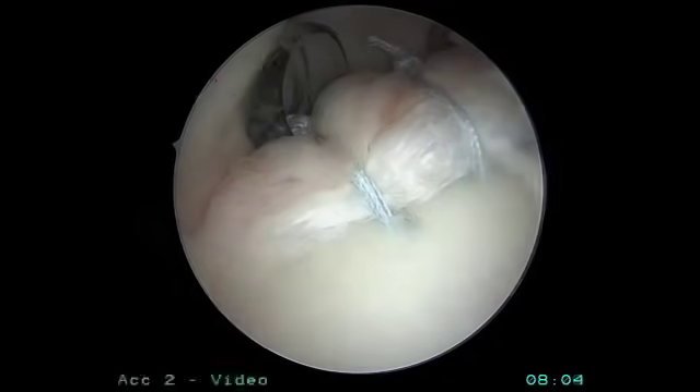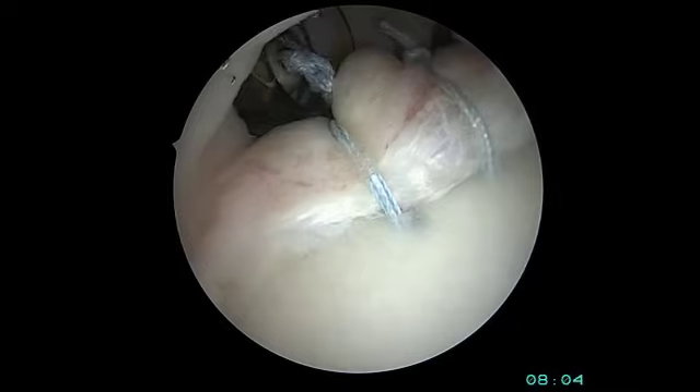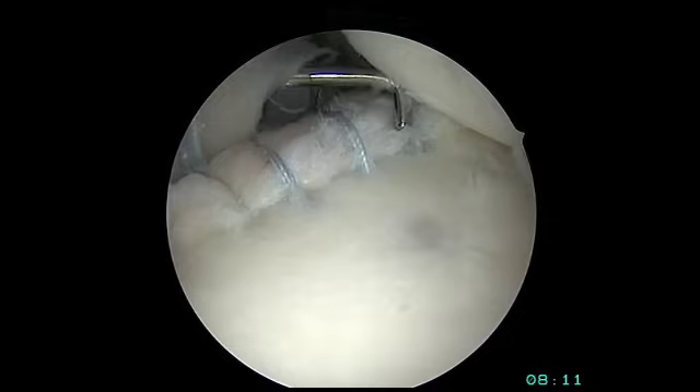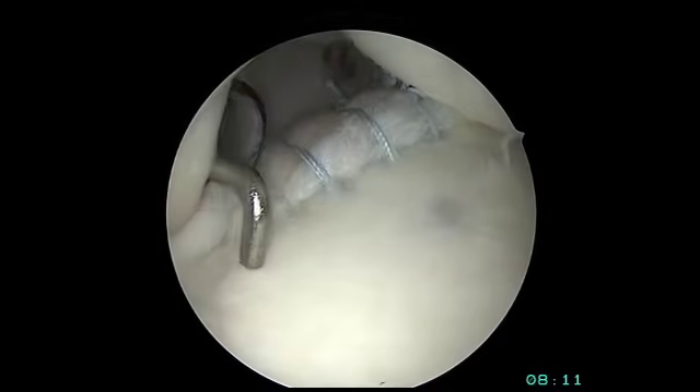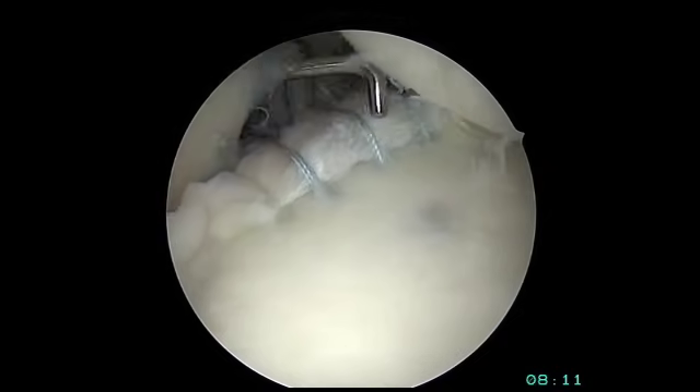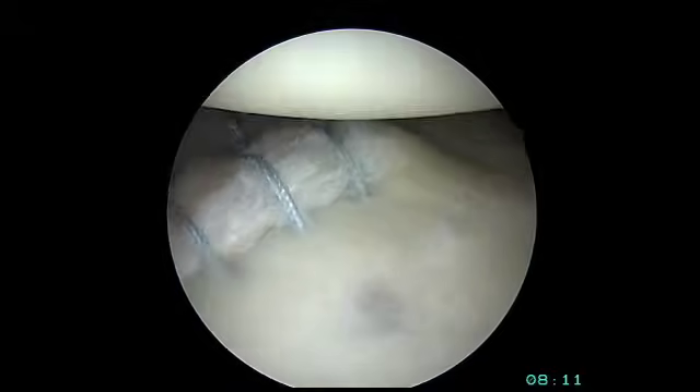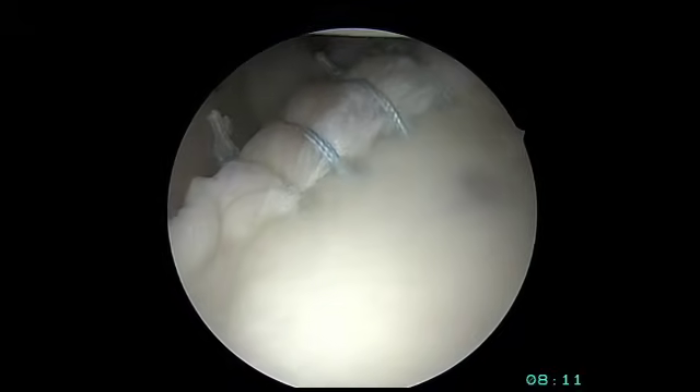The sutures are cut to give us a nicely anatomically restored posterior labrum. The probe can now evaluate the repair — you can see how it's securely placed back into the appropriate position so that it can heal back over time.